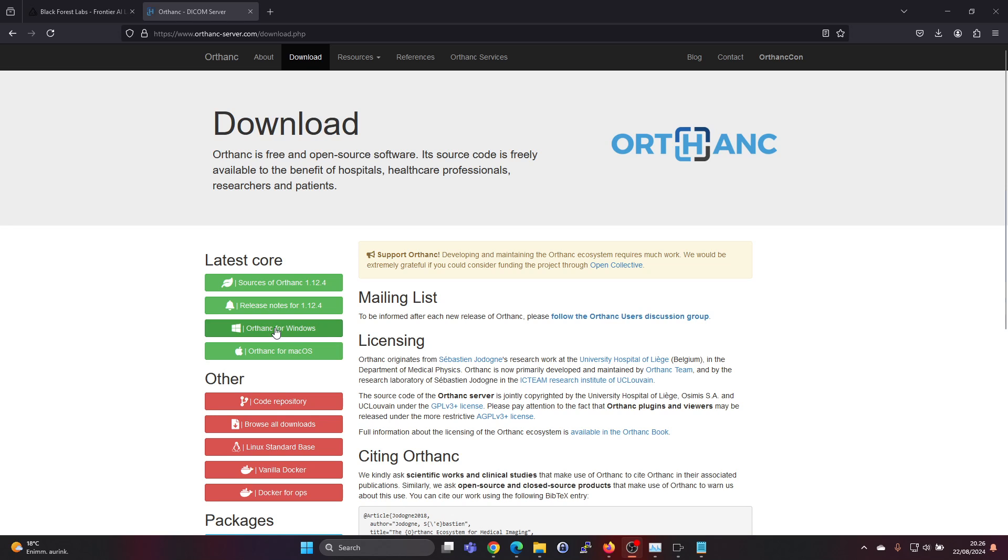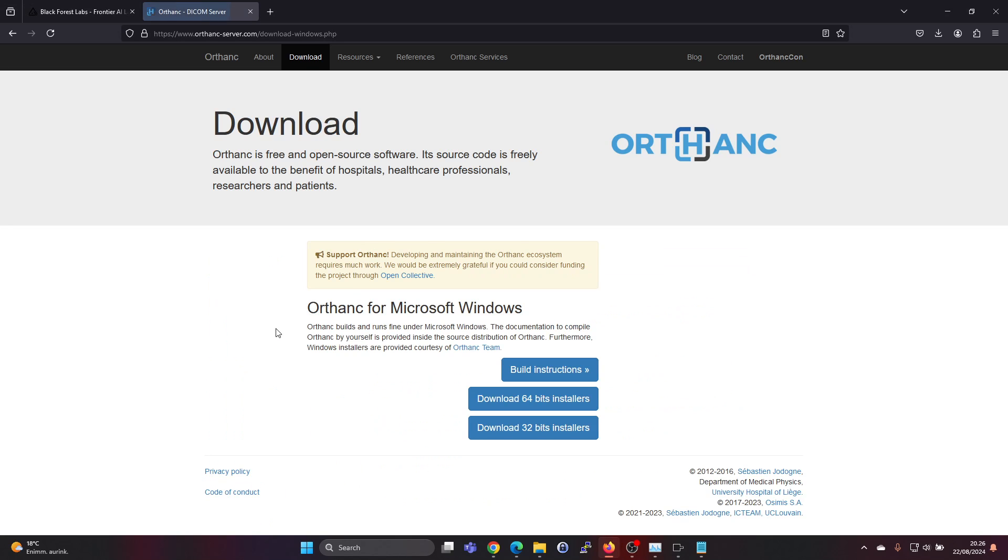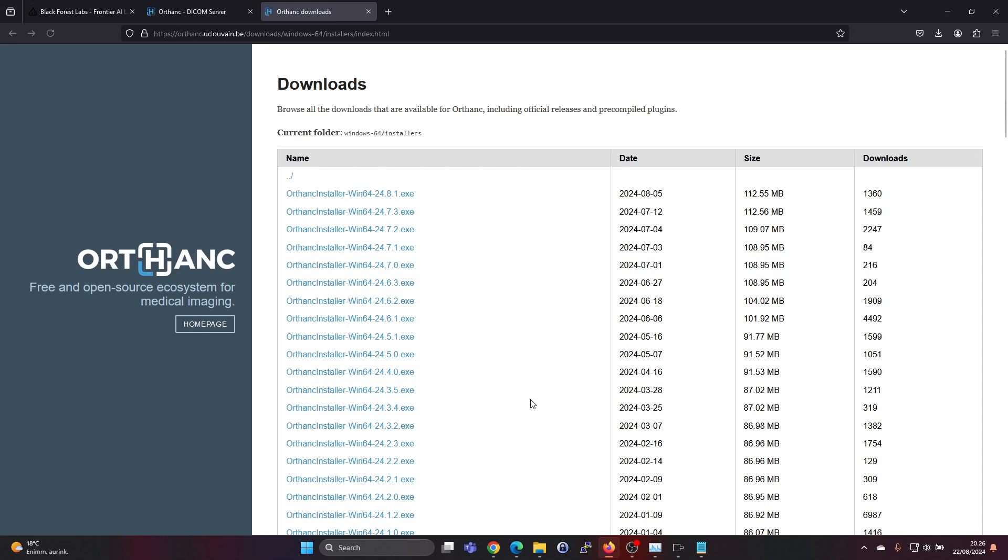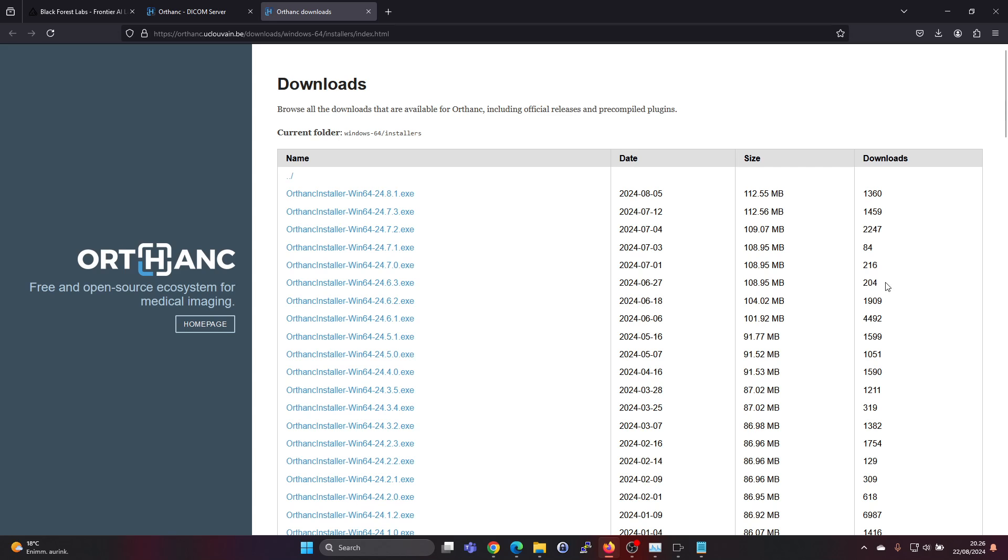So let's go ahead and click on the Orthanc for Windows and download the 64-bit installer. It seems that version 24.8.1 is the latest one.